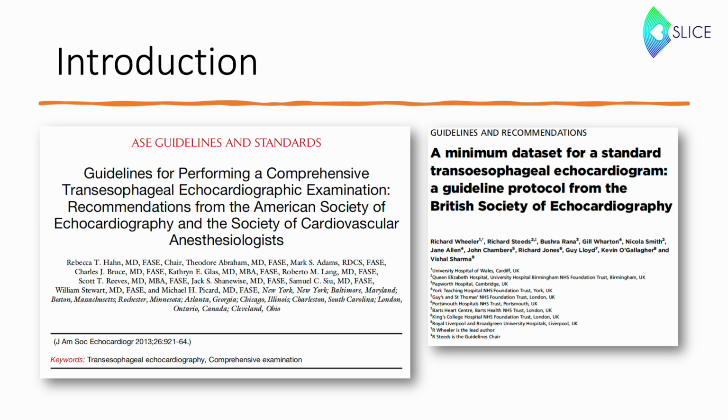The most comprehensive and foundational TOE guideline remains the ASE guideline published over 10 years ago by the American Society of Echocardiography. It summarizes key recommendations, available views, and measurements critical for comprehensive TOE examination. On the right, you can also see the BSE guideline, which is another valuable resource if you're interested in this topic.